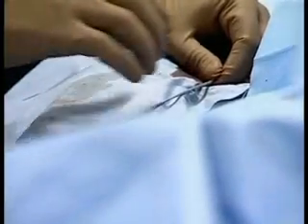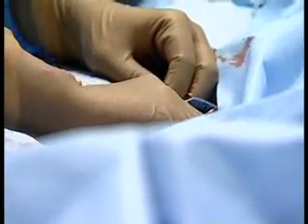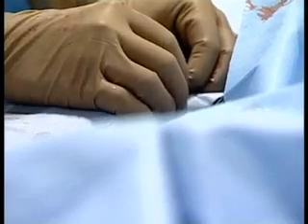Okay. Can you show the hemodynamics of the patient once, and then probably if you have anything particular to show, we can switch over to the other lab. Opening pressure was 190. Now what you're getting is the guiding pressure, but the catheter is in the lumen, so you can't see the pressure very well now. Okay.